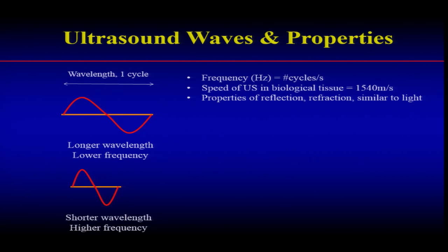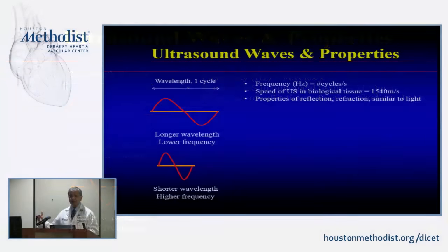And last but not least, just like any other waves, once you emit a sound or you send light or whatever it is, that sound can propagate depending on the milieu, can slow down. The best propagation is probably in a fluid. The lowest is in air or even no air. And some of it will be reflected, some will be refracted. These are terminologies that you may want to know, and it's similar to light. So let's go through some examples here.